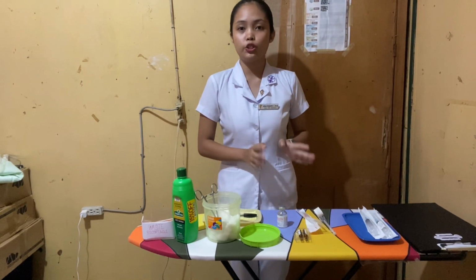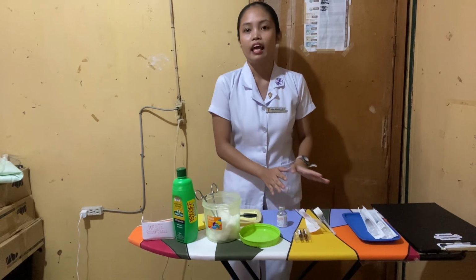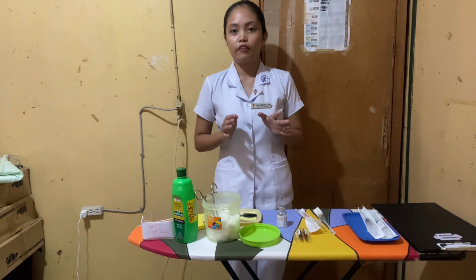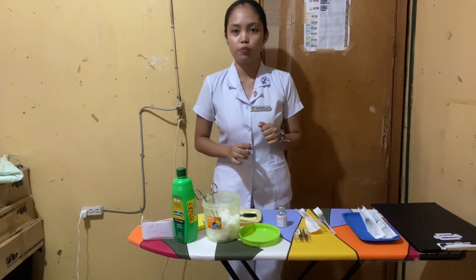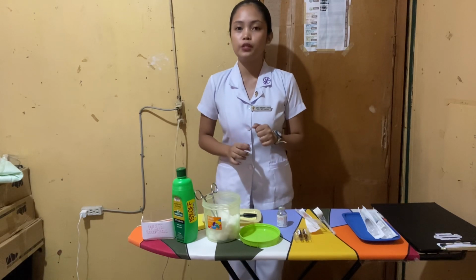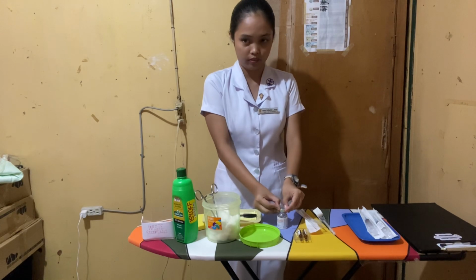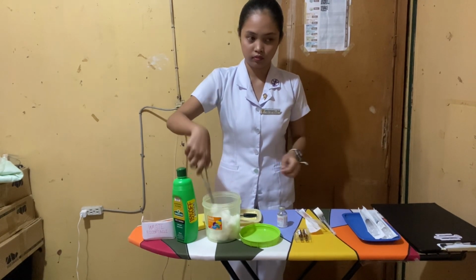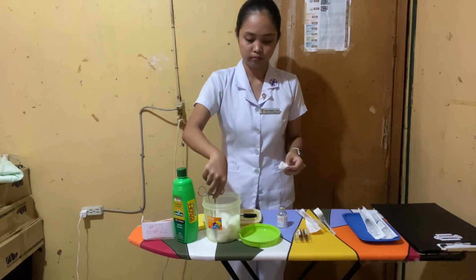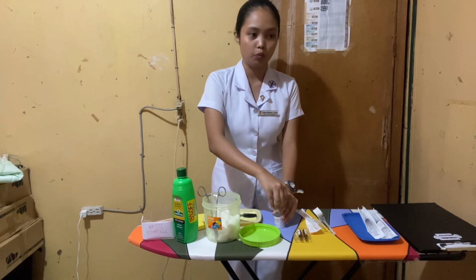Make sure that the connection isn't loose, and then I'm going to set it aside. Then I'm going to open the covering of the vial, and then the rubber seal is exposed, and now I'm going to clean it using a cotton ball soaked in 70% alcohol in a circular motion.